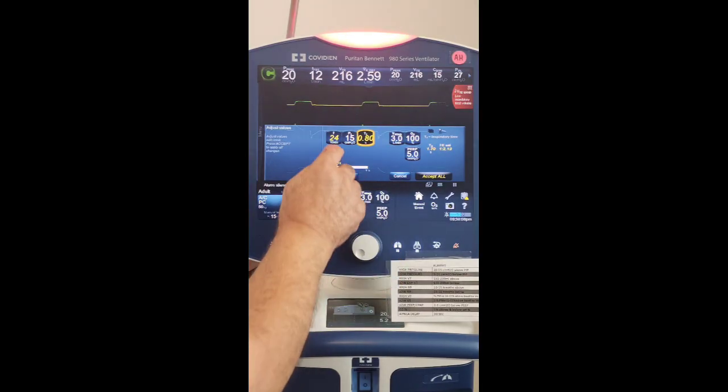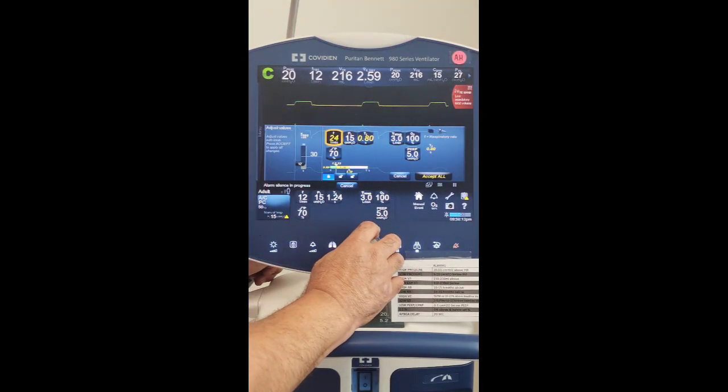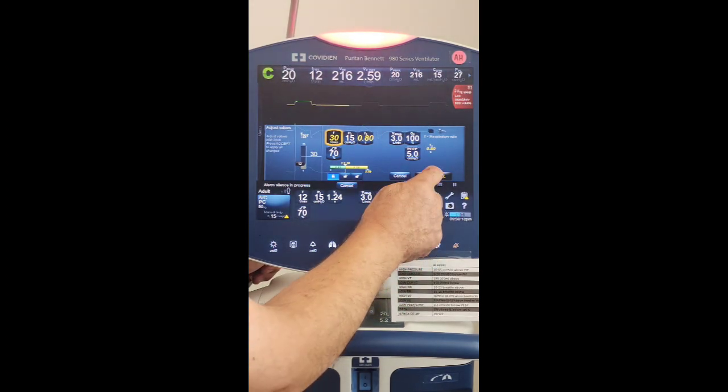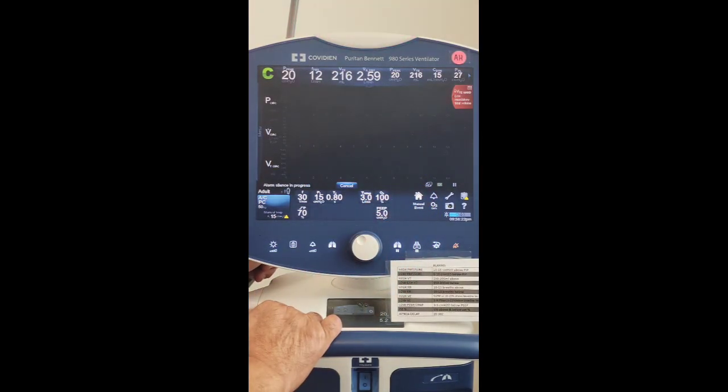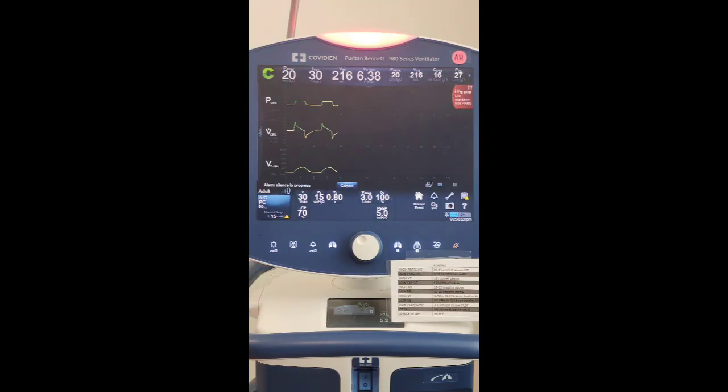0.8 seconds. And now I'm going to go up with my respiratory rate to 30. What did we say, 30? Yeah. So let's accept it. It's really a tight IE ratio too. We might have to change the I time again. So let's wait here. It's starting at 30 breaths a minute. That's what we set it. Immediately you can see minute ventilation has significantly improved.